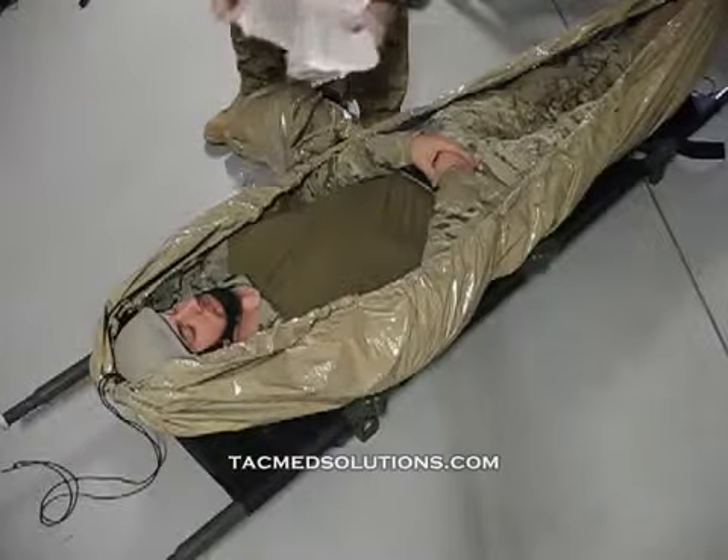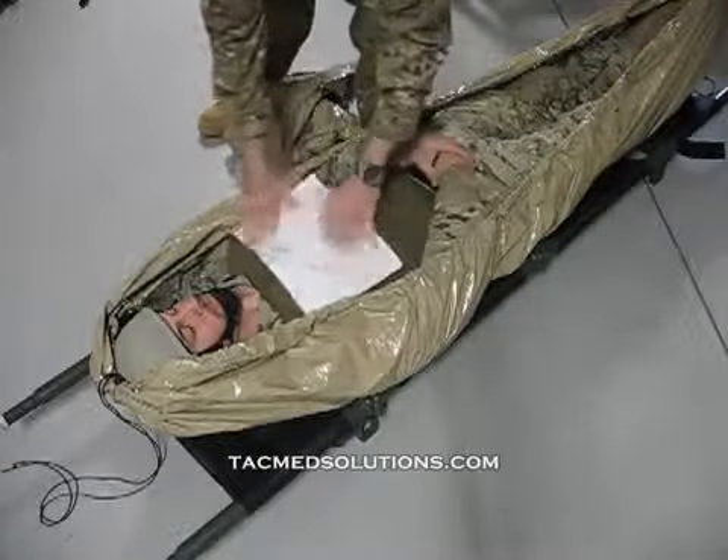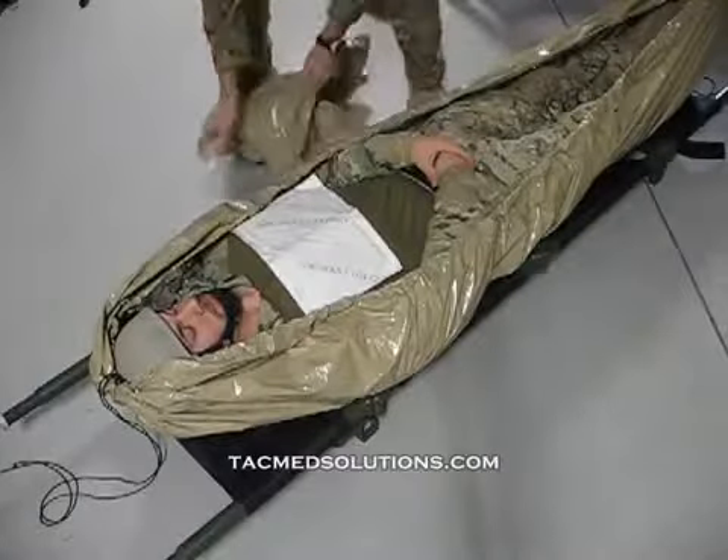If the Helios with active warming is used, the heater should be placed on the casualty's trunk. A layer of material should be left between the casualty and the warmer.